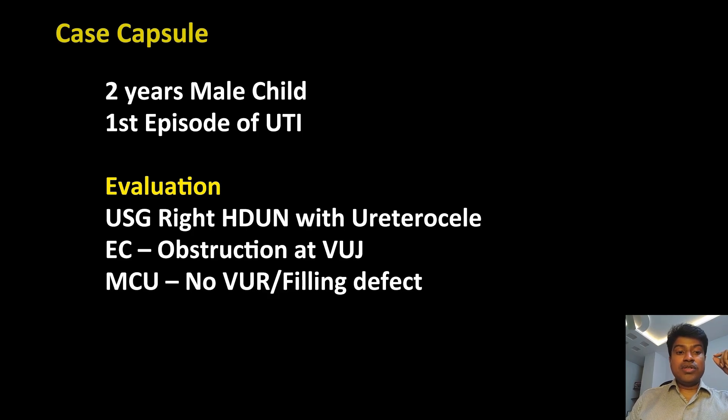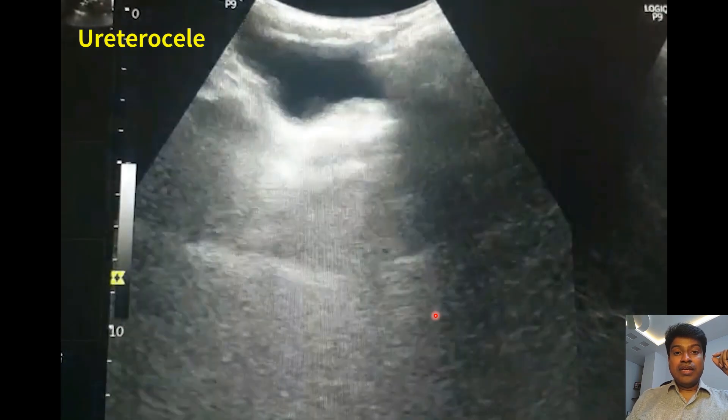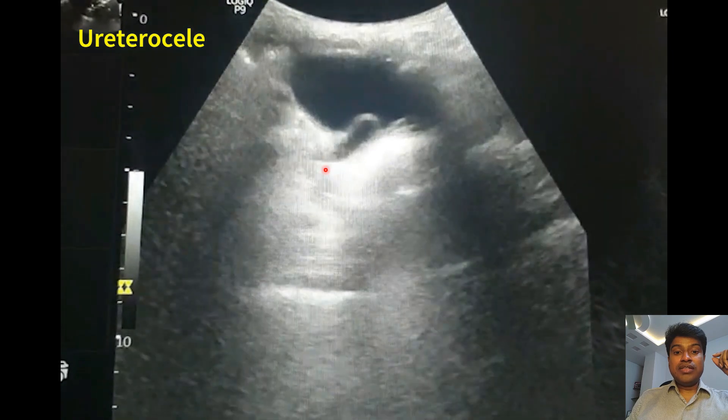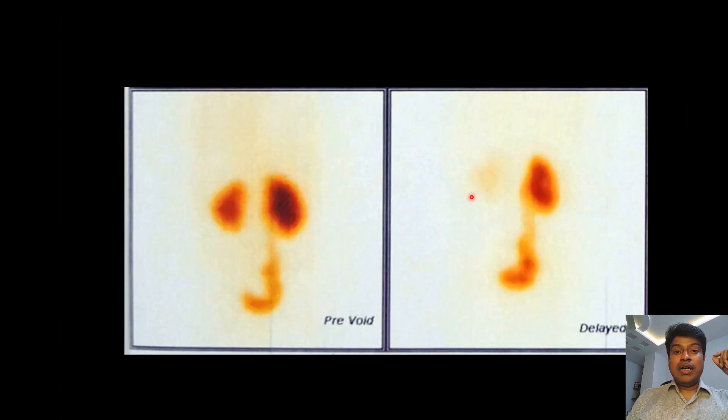Here is a two-year-old child with the first episode of UTI. The child has been evaluated and ultrasound showed right hydro ureteronephrosis with a ureterocele. This is the ultrasound picture and you can see the ureterocele pouting into the bladder. An EC renogram shows obstruction at the level of the VUJ.